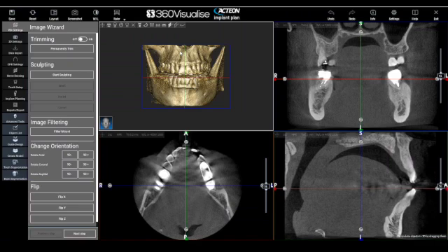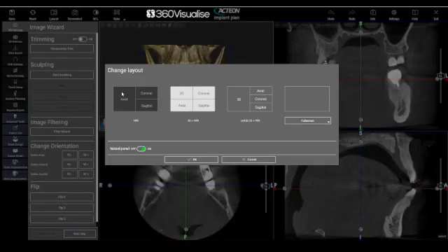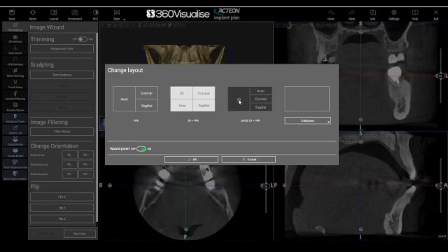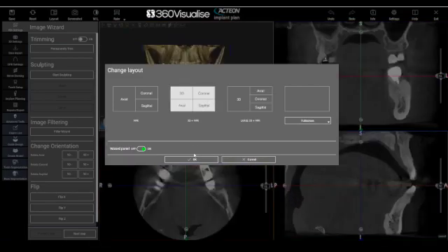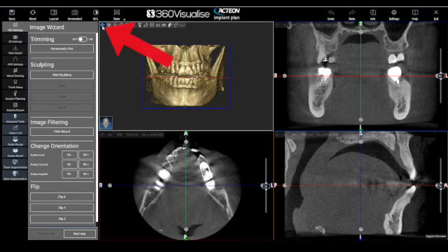In AIS 3D, we can change the views by using the Layout button near the top left corner. Click Layout and choose the option you prefer and confirm by clicking OK. You can toggle Fullscreen by clicking this button once to go into Fullscreen and again to go back.